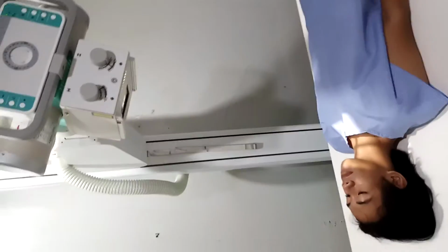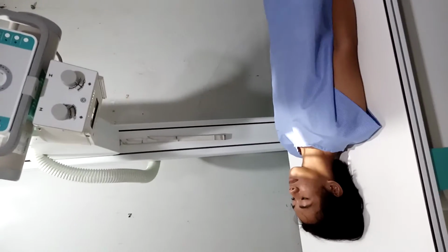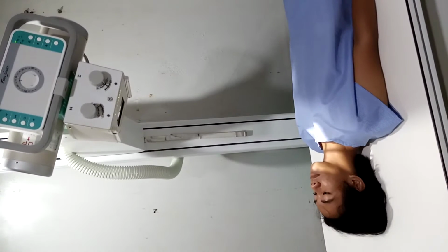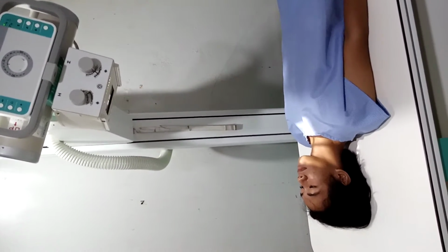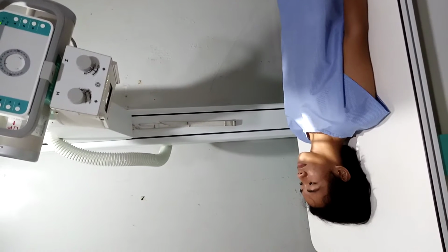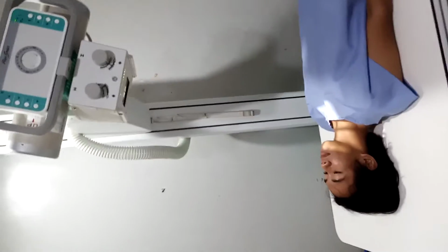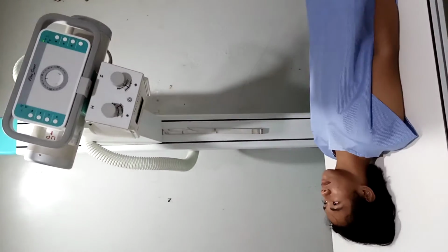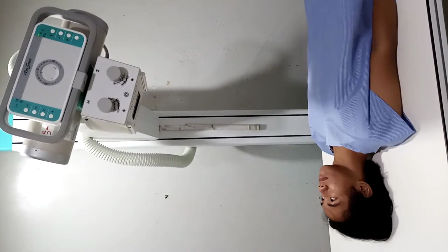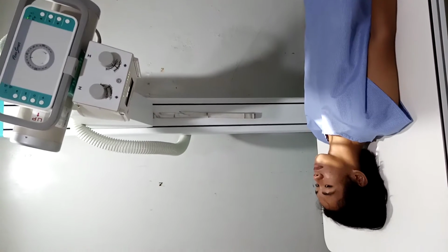In criteria evaluation, for the anatomy demonstrated, the C3 to T2, the cervical 3 and the thoracic 2 vertebral bodies must be clearly demonstrated on the radiograph. The spaces between the pedicles and intervertebral discs are clearly seen.